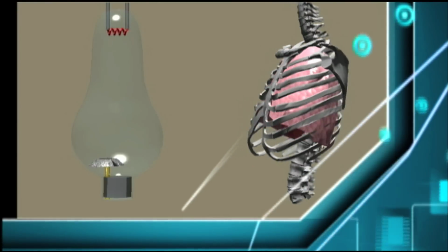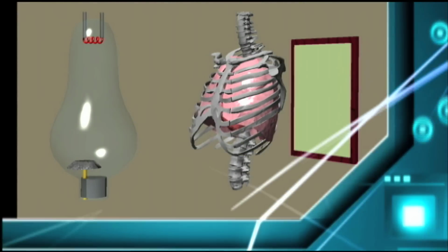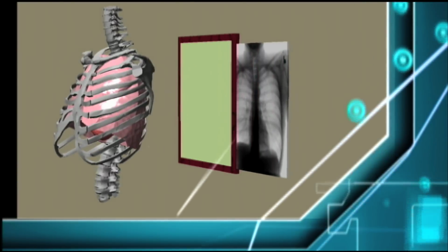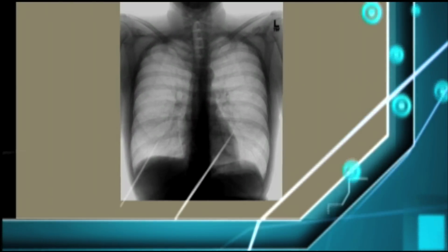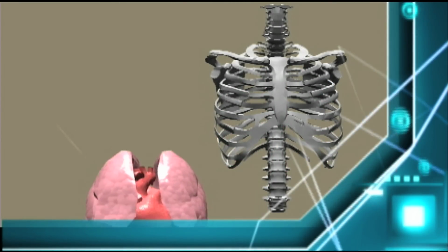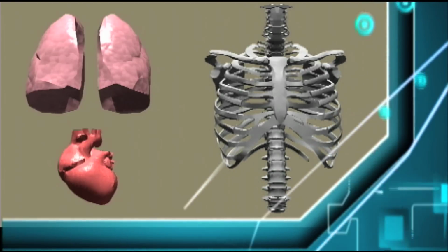To understand the importance of CT scanning, it's important to know the limitations of a standard radiographic technique. A radiograph basically consists of a source of X-rays. Those are projected through the body, and all of that is recorded on a sheet of film on the other side of the patient. The problem, of course, is that we're taking a three-dimensional object and placing all of that onto a 2D sheet of film. So all of these three-dimensional volumetric structures inside the chest are going to be represented on a flat sheet of film, and there's superimposition of shadows, and so on and so forth.